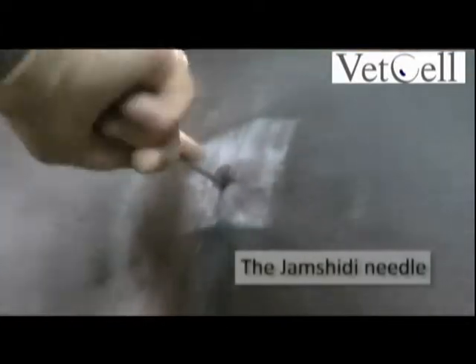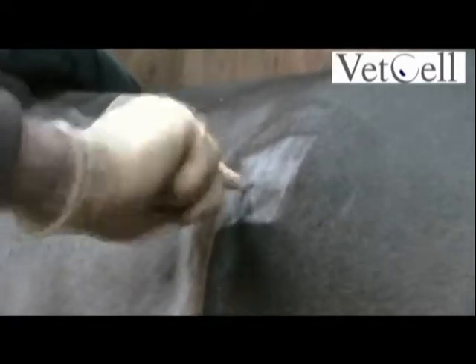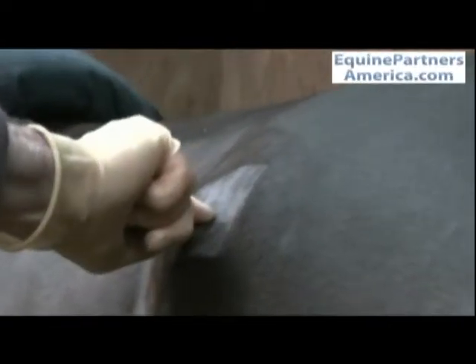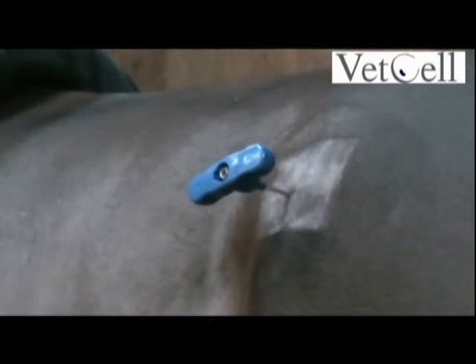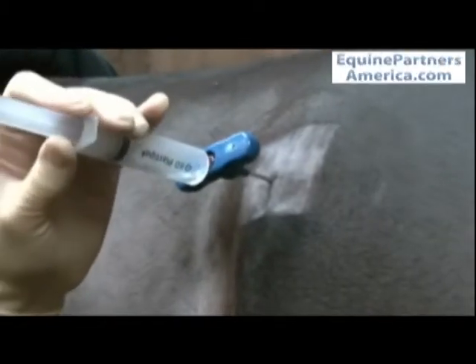Is it going to slide along or is it going to dig nicely in there? So that's ready to go. I go in slightly on a ventral angle just to start with, to get purchase in the bone. And when I've got purchase, then I alter it to a horizontal plane. Sometimes you can appreciate that it gets a little bit easier to push in — that's when it's arrived in the bone marrow cavity. And that's it.